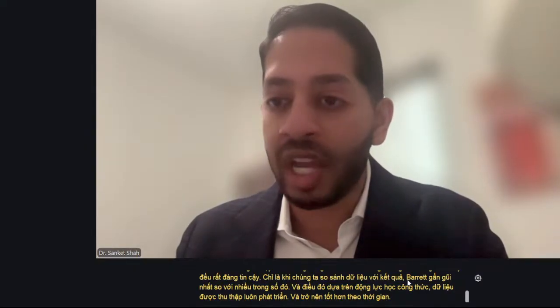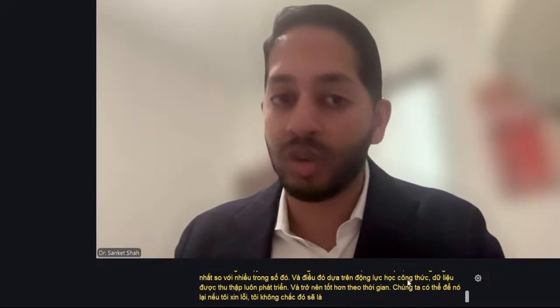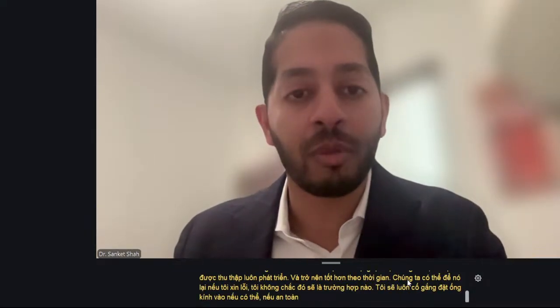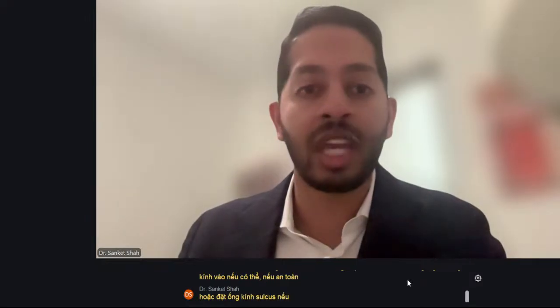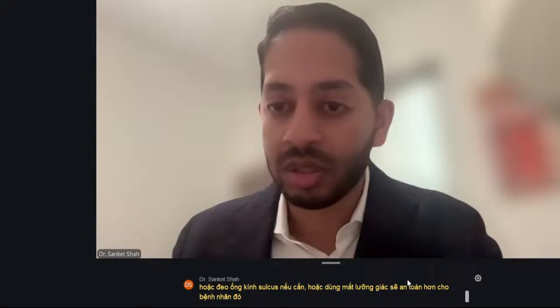Can we leave it if I am, sorry, I'm not sure which case that would be. I would always try to put a lens in if possible, if safe. Either put a sulcus lens if you need to, or having a bicameral eye will be a little safer for that patient long term if possible.